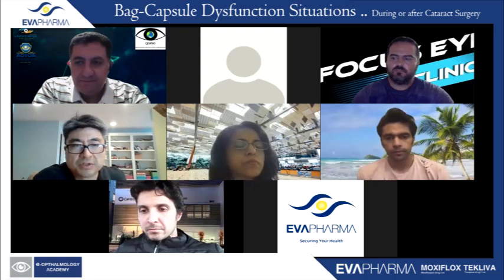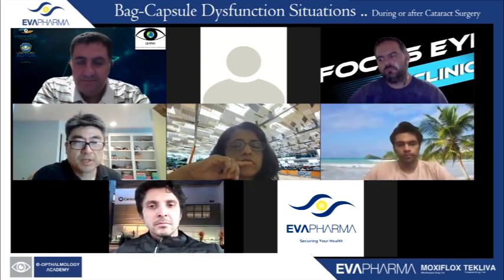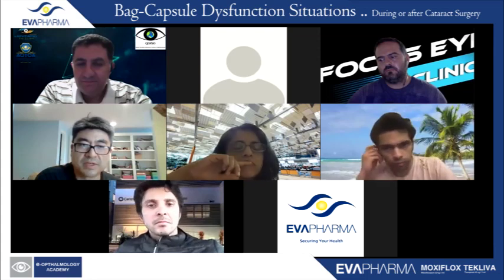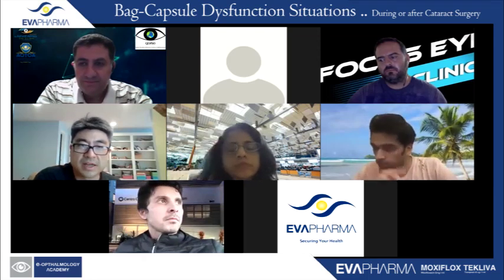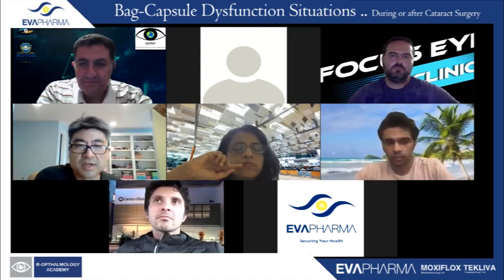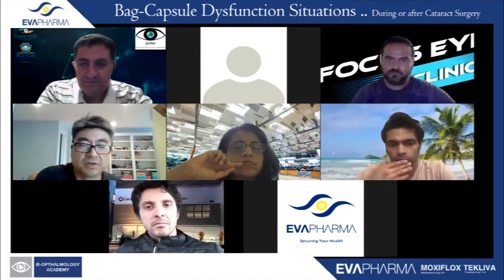The short answer is really experience and getting used to the maneuvers. A lot of the maneuvers are so challenging that sometimes the angle can fall by the wayside. You're so focused on doing the technique right, and then you don't get that angle right. You're like, yay, I did it, and then you look and the lens is very tilted. So it requires attention to detail at all phases of the procedure.